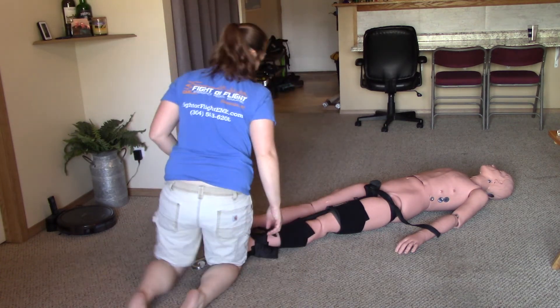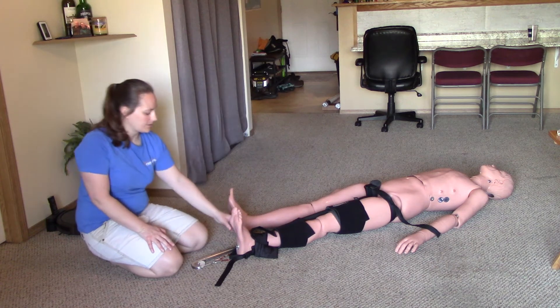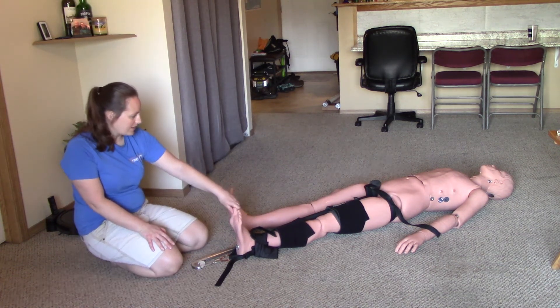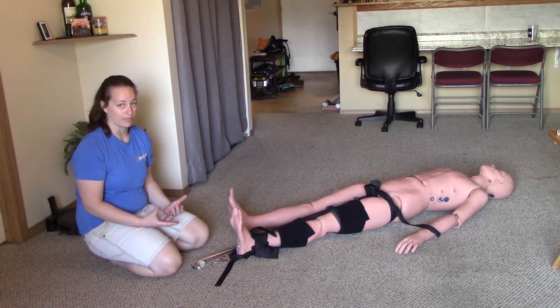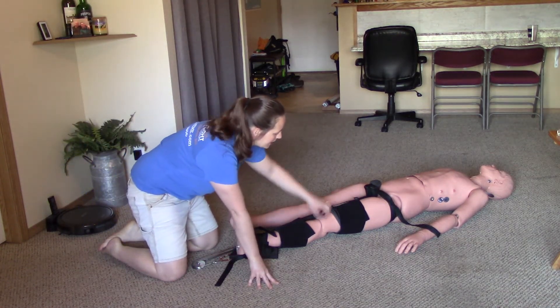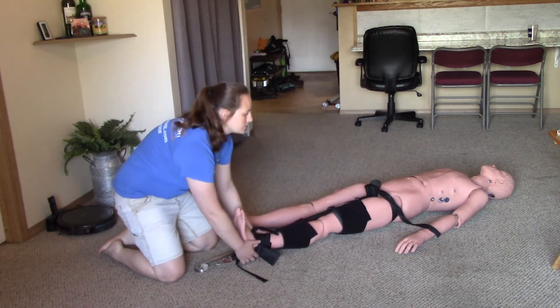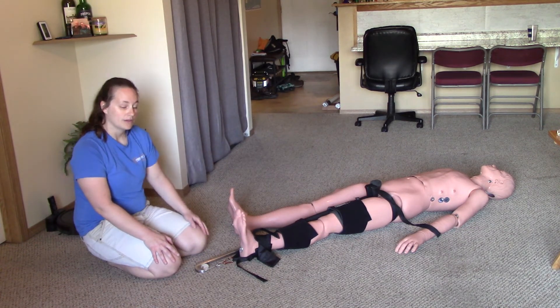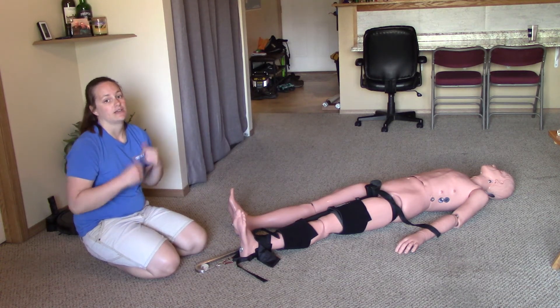At this point I have secured my splint to my patient, so I will recheck CSMs — feel for a pedal pulse and ask the patient to wiggle their toes. I will then secure my patient and the splint to a backboard, because they have a broken femur and I need to secure both the knee and the hip. Right now the patient can still move their hip, so they're not fully immobilized. I'll immobilize the patient to a long backboard, secure the splint and patient to the backboard, recheck CSMs, and then transport.